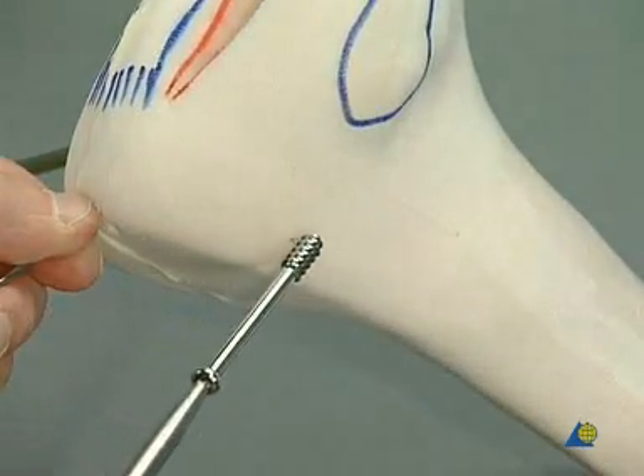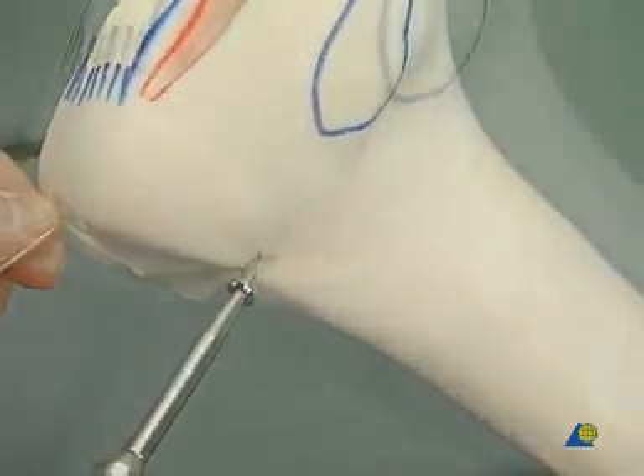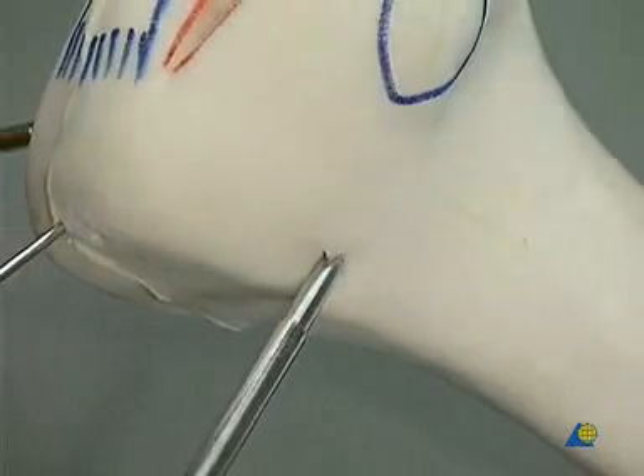A second 6.5 mm cancellous bone screw with a short thread is inserted. Once again, tightening is done by hand.